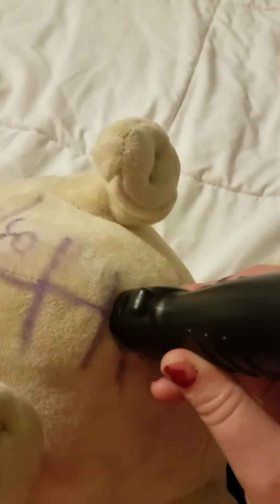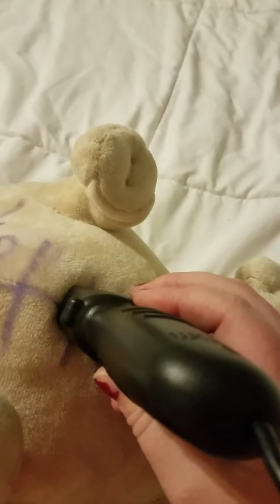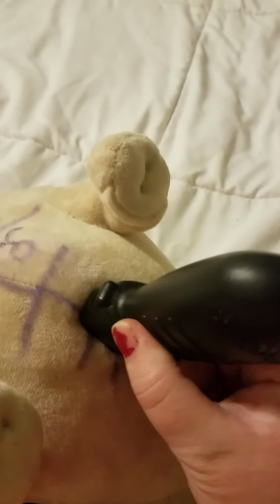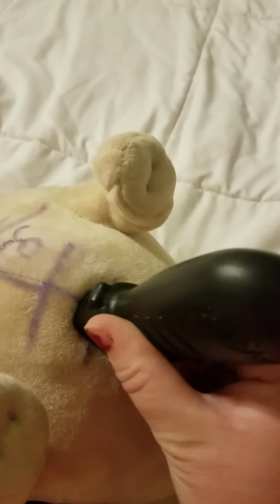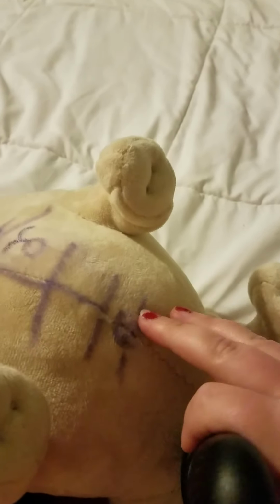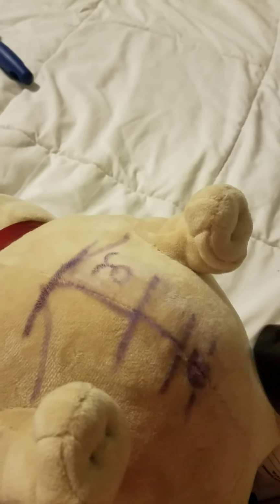So then after you get all of those measurements, you are going to slide back up to your distal, and then you're going to make sure that you have a good image of that bifurcation, because that's where your distal is right before that bifurcation. So you got your distal and your long and your short, and then make sure that you go down just below that, and you're going to see that bifurcation and then you're going to see it into 2 separate iliac arteries down here. And then that is your abdominal aorta protocol.